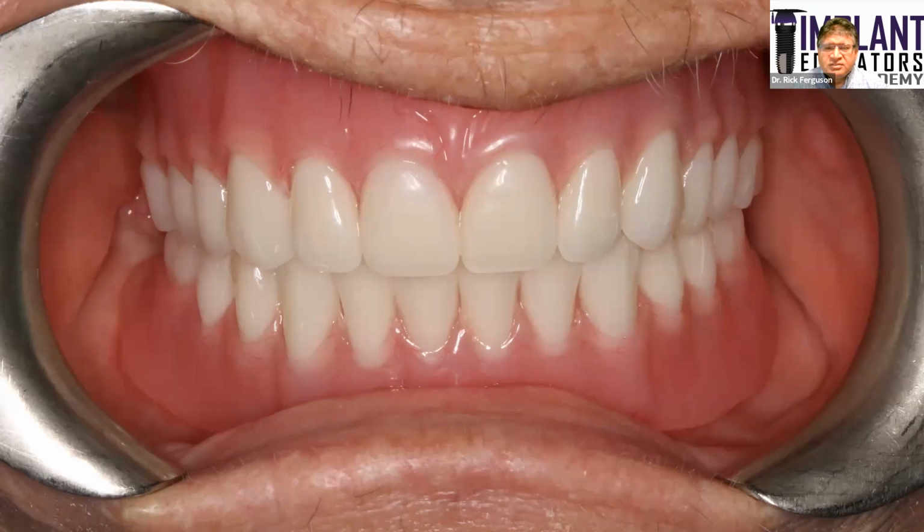3D printed dentures, in my opinion, are not really adequate for final dentures at this point. Hopefully some of the newer resins like the Flexura base and the Flexura teeth resins will prove long-term that they're as good as conventional acrylic. But right now, either milled or conventional acrylic techniques are, in my opinion, stronger than 3D printed dentures. So for 3D printing, we're using dentures as temporary dentures or immediate dentures, okay?